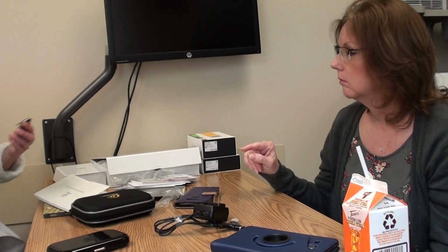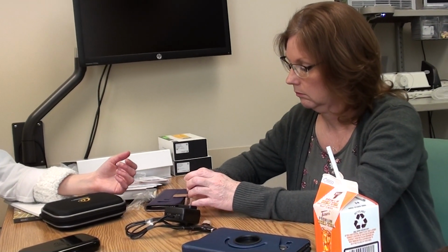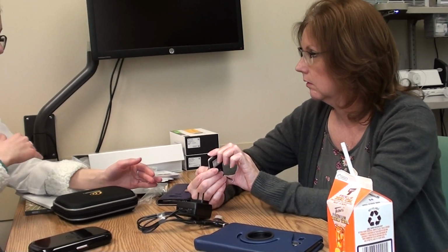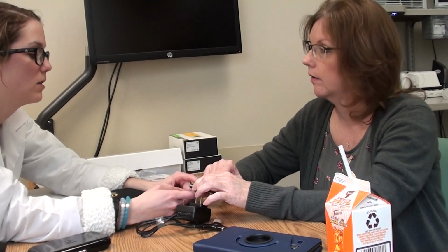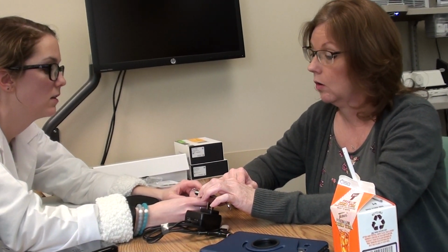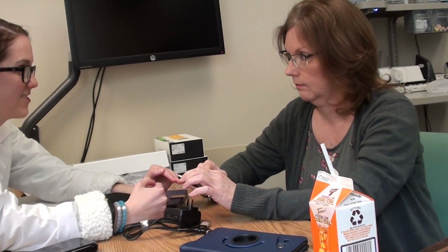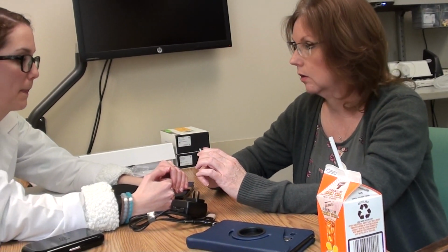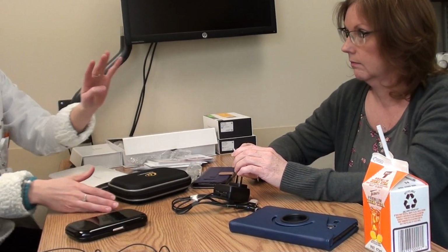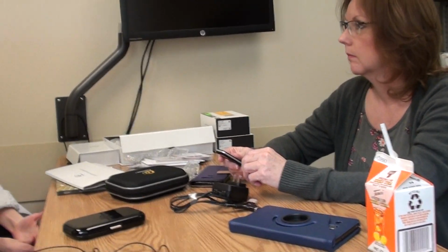What if she was somewhere with her son, like in a sports thing, in a gym or something, and they were screaming or something? That would be maybe something program 4 would be used for? Or she can just use the volume and press it up. It'll go to 7 and then 8. But try and stay at around 6. Try to stay on that, okay. If you need to go down to 4, but try not to go lower than 4, okay.